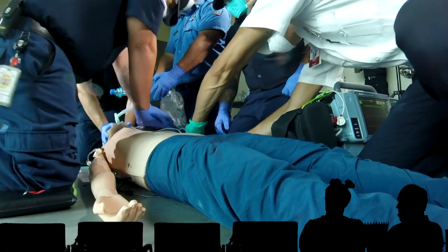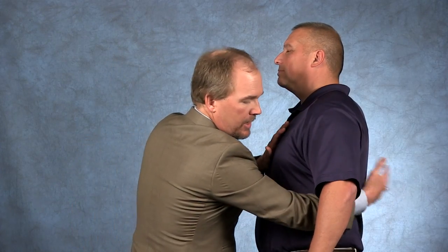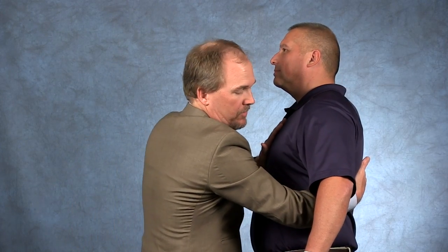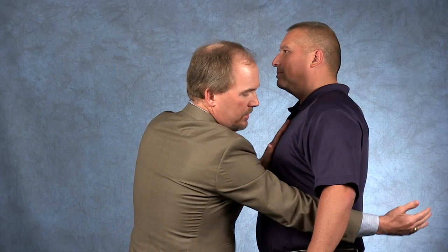I'm going to pause right here. For pad placement with dual-sequence defibrillation, go your normal anterior and apex — anterior, lateral. Then for the second pad placement, come anterior here right over the front of the heart, and posterior behind the back of the heart. So anterior-posterior and anterior-apex, or anterior-lateral. This needs to be on top and behind, right over where the heart is.